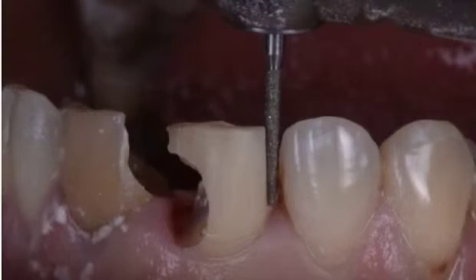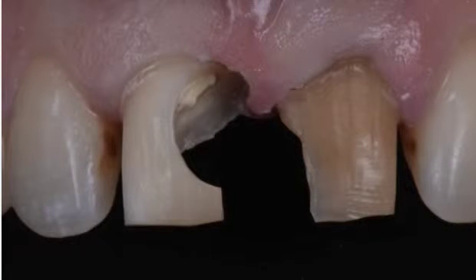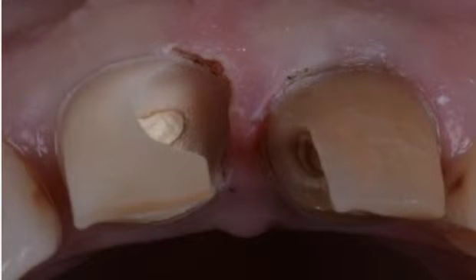So we had to do our treatment in a so-called more conservative way, but the problem was not only the restorative part, but periodontal as well, as I mentioned, and the isolation as well. To be able to isolate this kind of stuff, we need special clamps and the heavy rubber dam for sure.